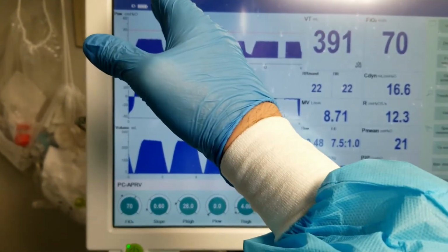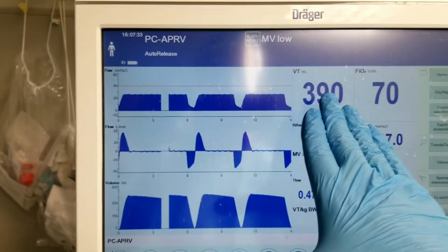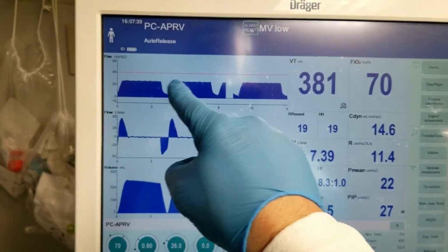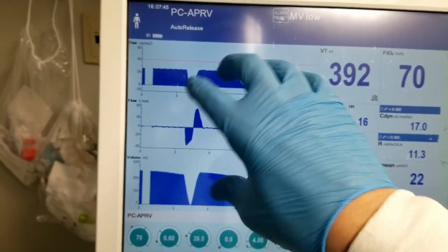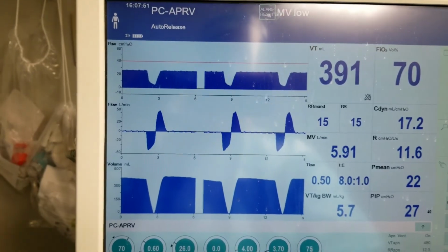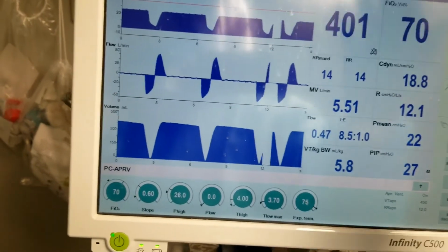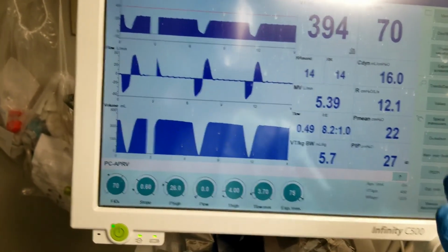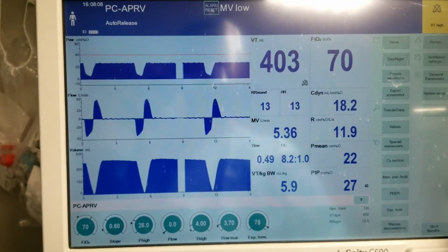So you start with ACPC, you start with a PC profile, and as you look at the diffusion capacity of the patient, then you stretch it out and optimize it. Because you're stretching it out, this area here, while it is inflated on the P high, if the patient has the capacity to diffuse, he's going to be diffusing. So those releases are going to be a lot more potent with CO2. Therefore, you often can have a much lower minute ventilation, or a much lower rate, and that makes the chest move less, and that's a good thing. So that's kind of my crazy bias on APRV.